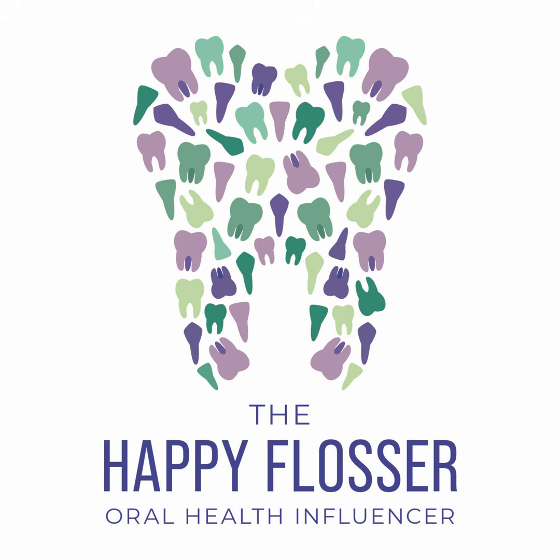You also want to have the same amount of powder to water ratio when you're in the dental materials lab pouring up your models, and that will impact the strength and integrity of the actual model. So maybe some students break off the teeth when they separate the models because they didn't have the right ratio. Maybe the stone was too thick or too thin so that it lost its integrity.